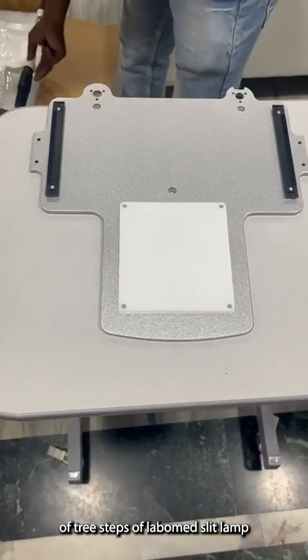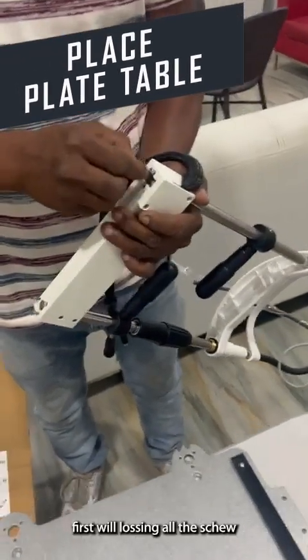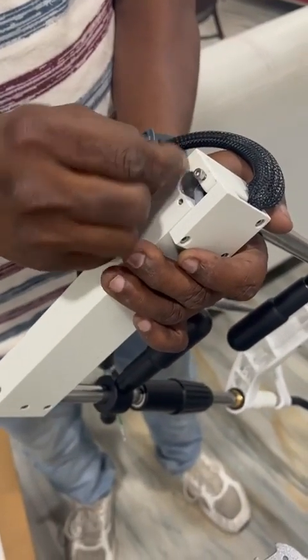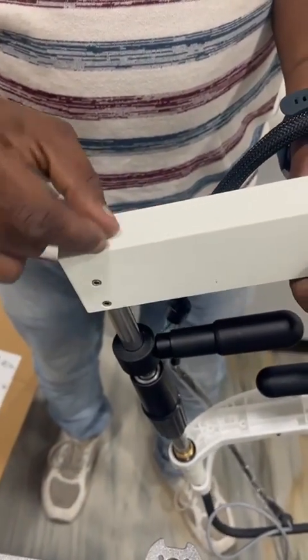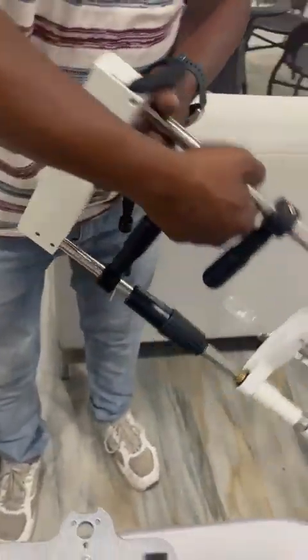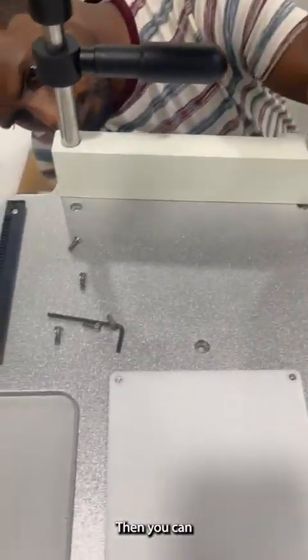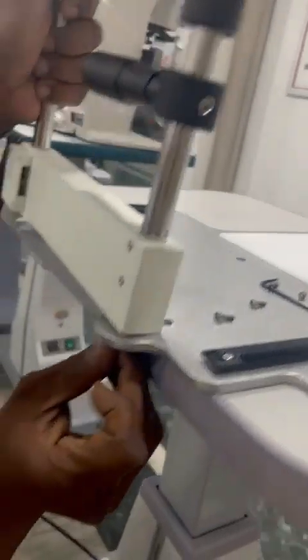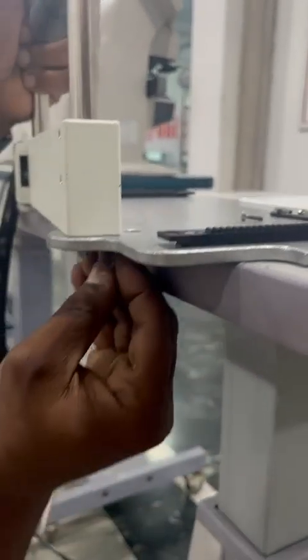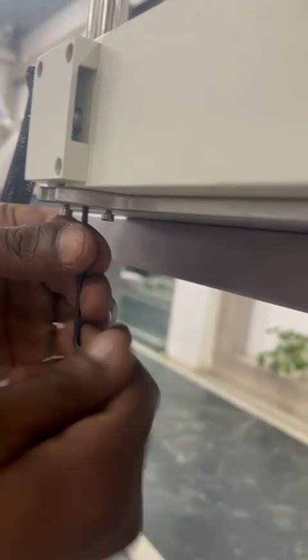This is the installation of the 3-stack Laboment Slit Lamp, which we will show in this video. First, you have to loosen all the screws. Then you have to mount it. Then you have to re-tighten the screws.